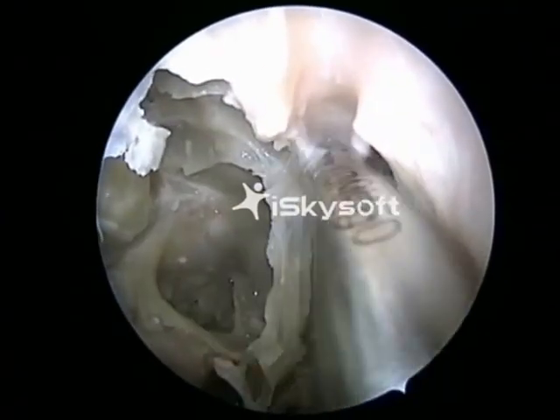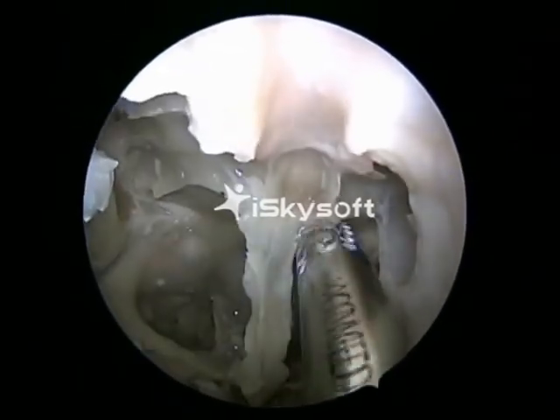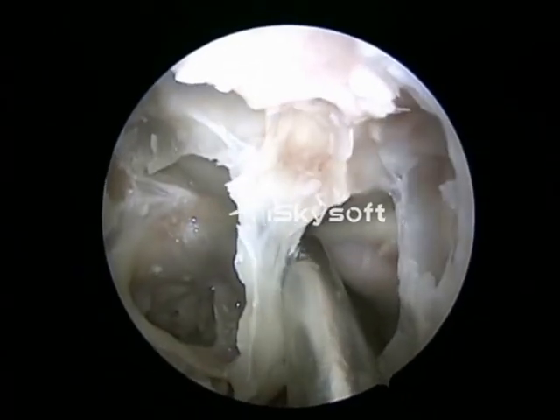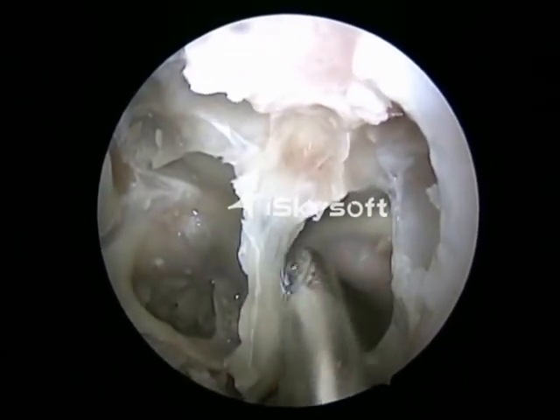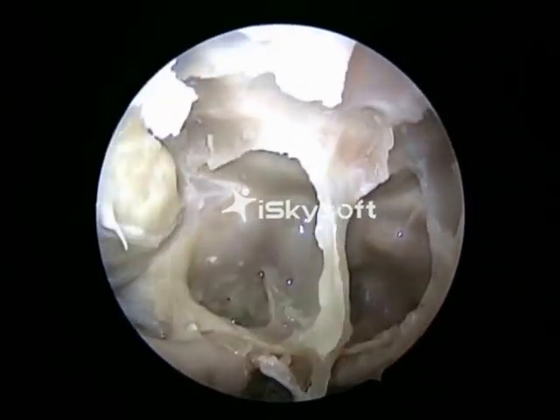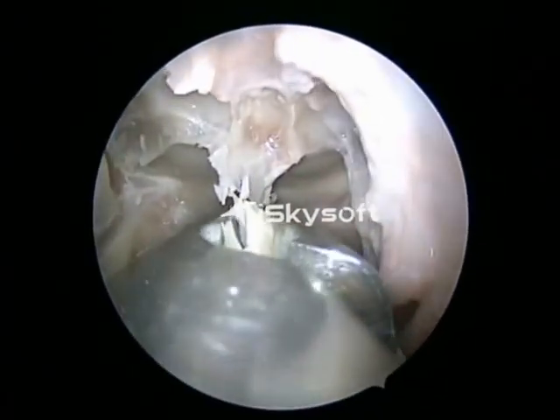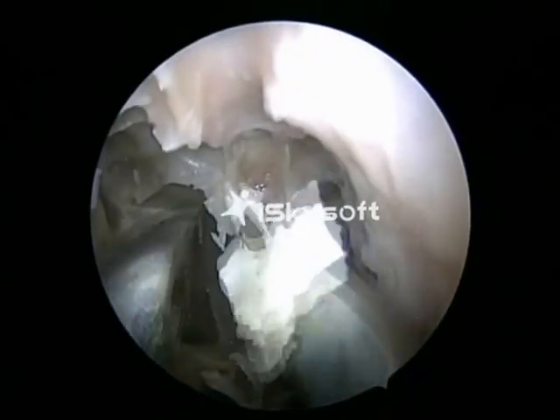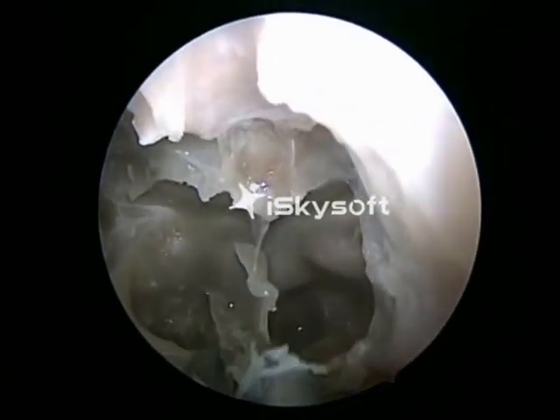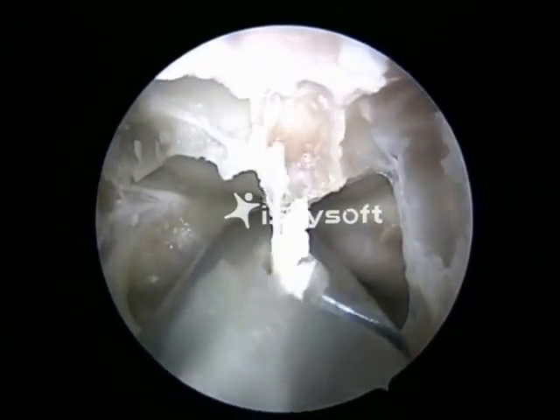You can see the intersphenoidal septum now in the midline of your picture. The intersphenoidal septum usually ends in the internal carotid artery on one side. It's never in the center. We use a bone punch to take the intersphenoidal septum out. It is better not to avulse that bone because it might get inserted onto the carotid, which might be dehiscent and it might lead to complications.